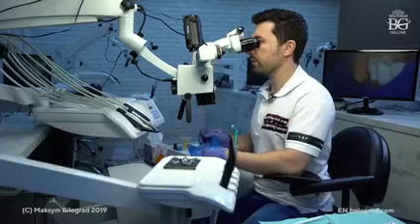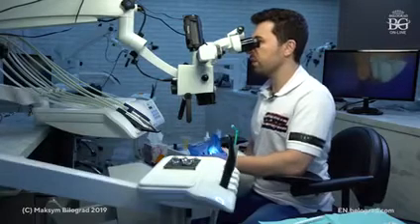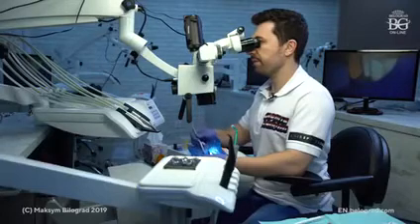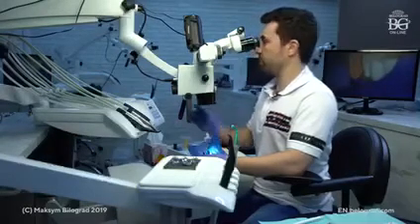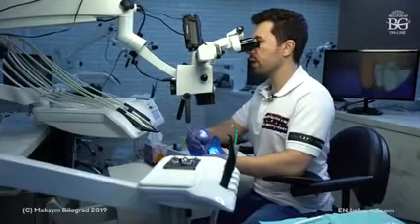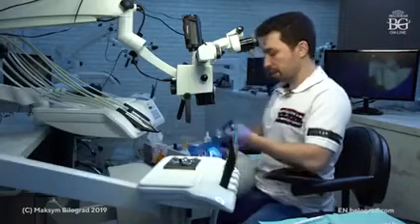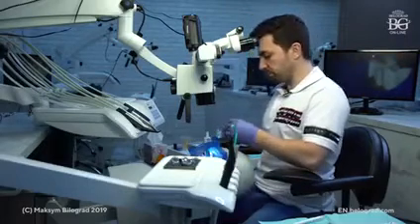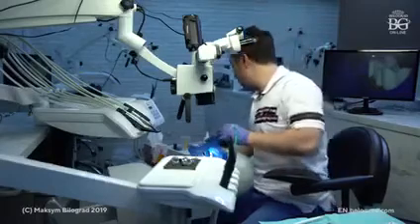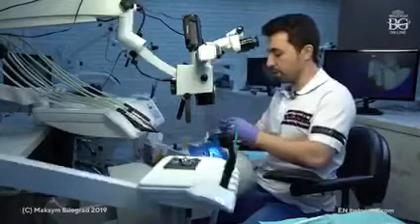Okay. Let me check here. The tip of the cusp that we have prepped, and the buccal surface. Okay, that's fine. So basically we are having pretty good preparations, enough space for the dental technician.